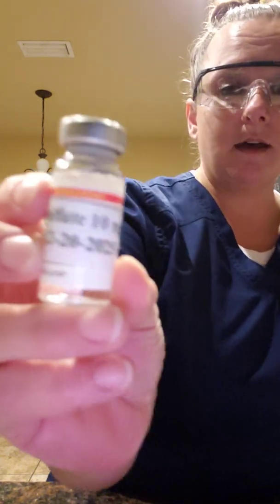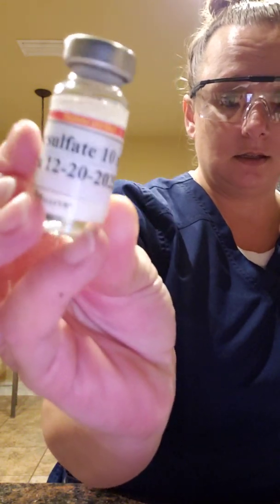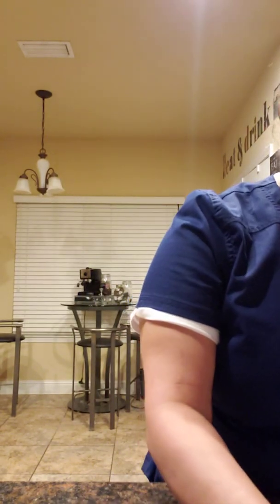Now we'll perform hand hygiene. I will get the right medication from the drawer. Morphine sulfate, 10 milligrams per 1 milliliter, 12/20/25 is the expiration date, so it is still in date. I will get a 3 milliliter syringe, blunt tip cannula, and 23 gauge needle.